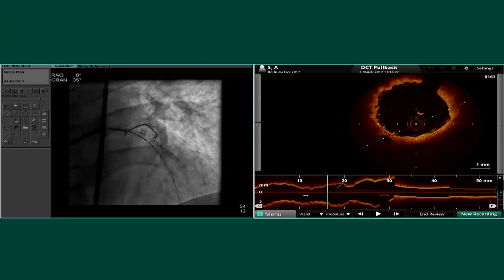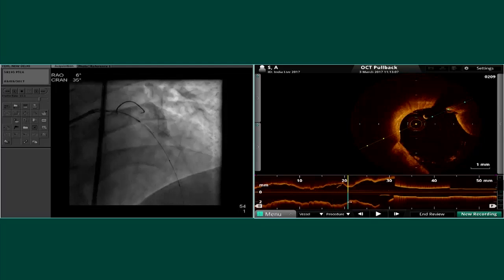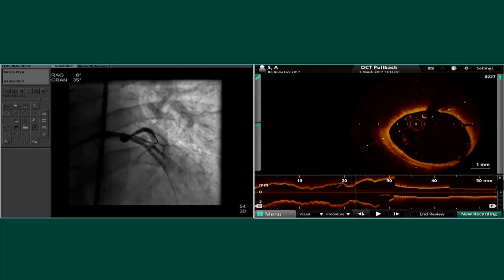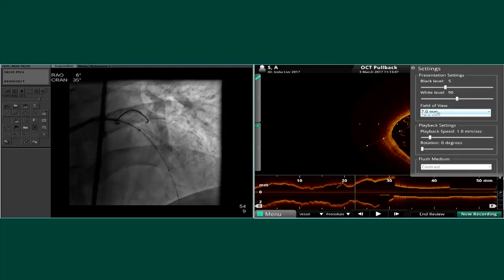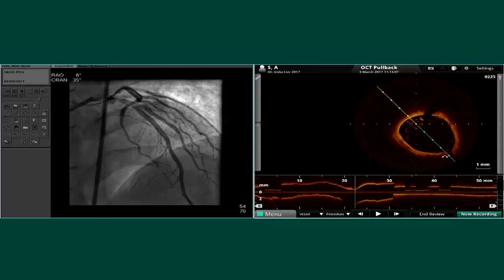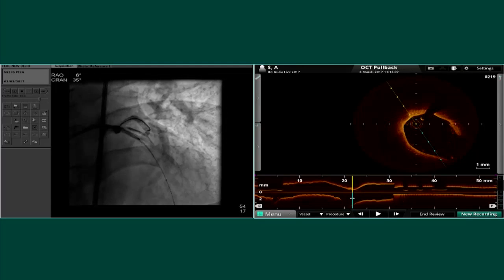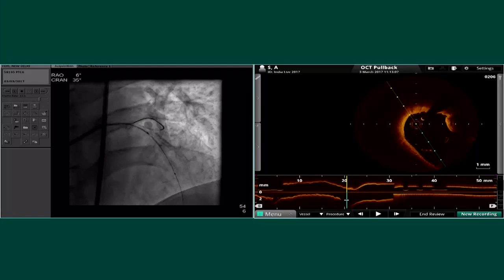Okay, so let's just get back to the left main. All opposed here. Come back more. Well, no. There were some struts there. Slowly. This strut. It's rotated to the circumflex. Okay, now you show me where these struts are. They are a little bit proximal to the circumflex, and that's the area which is very difficult to get.